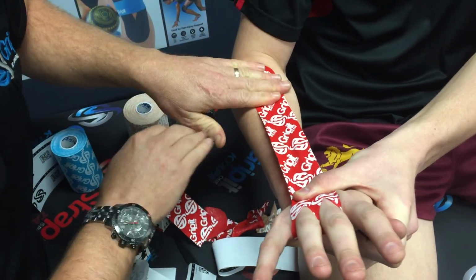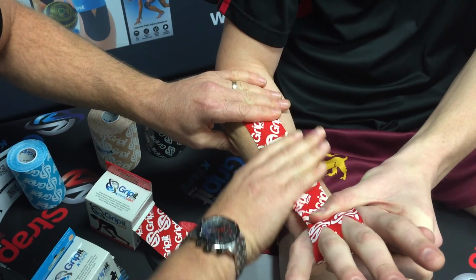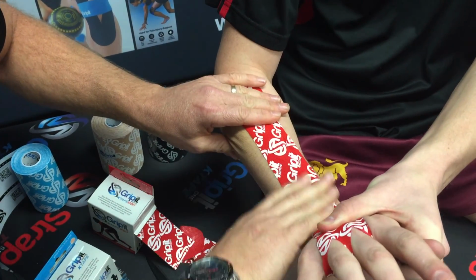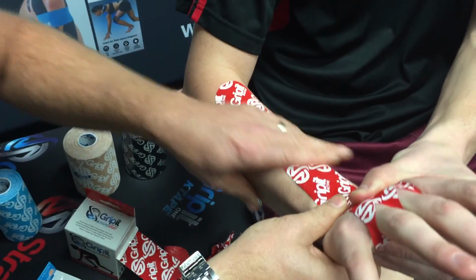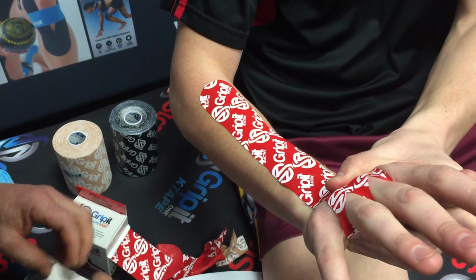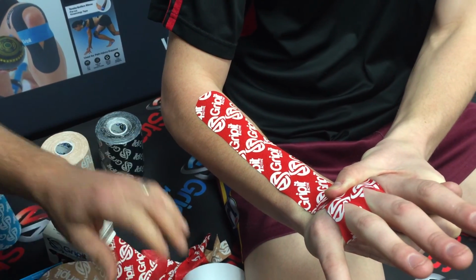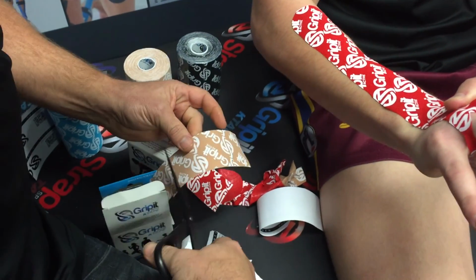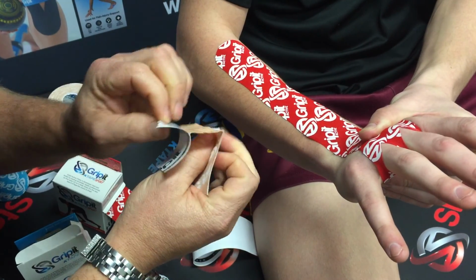Okay, so now I'm just going to hold that there. Yep, hold your wrist up. So while he holds his wrist up, we really start to plant down and work the tape into the skin and get that nice and sticky. Keep your wrist there, buddy. Okay, and from there, we grab our tape, and this one's just slipped back in the box. So we put our support band across the wrist to hold the tape in place. Remember I said like a retinaculum?